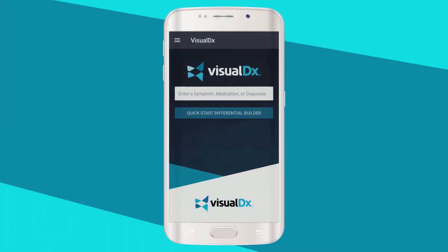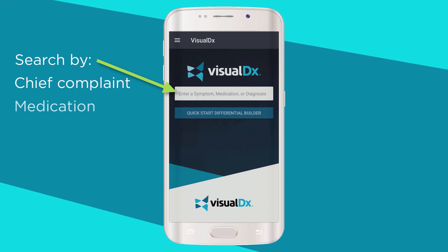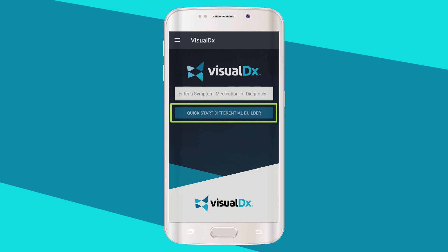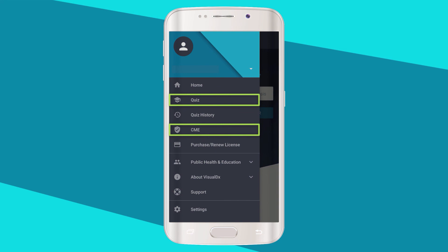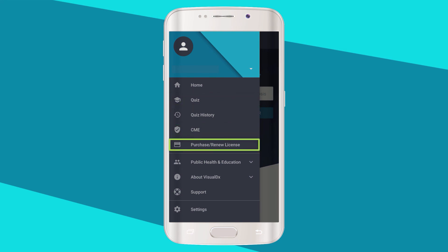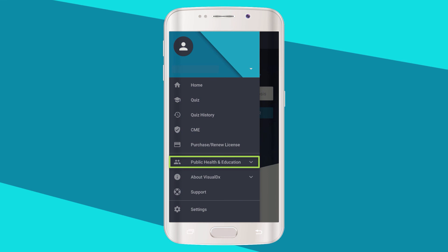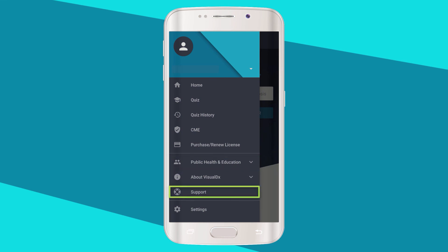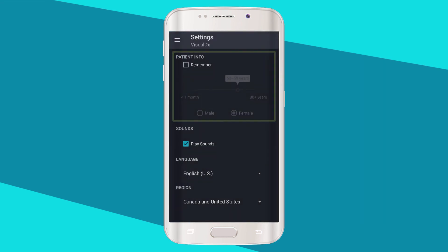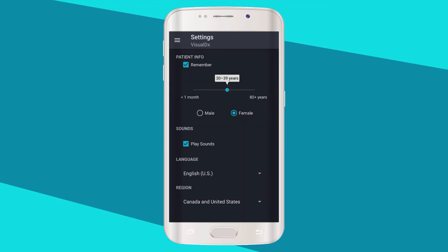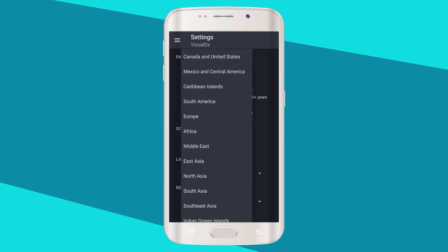The VisualDx homepage on Android is simply designed to help you start building a differential. Begin by typing a chief complaint, medication, diagnosis, or travel finding. You can also click the Quick Start Differential Builder to start building a differential from the most common chief complaints. Click the top left menu to access other features including quiz and CME. You can also purchase or renew your license, access information on public health and education, learn more about VisualDx, contact support, and adjust your settings. In settings, you can change your default patient age and sex as well as the region in which you are working. Changing the region will show diagnoses endemic to that region when appropriate.